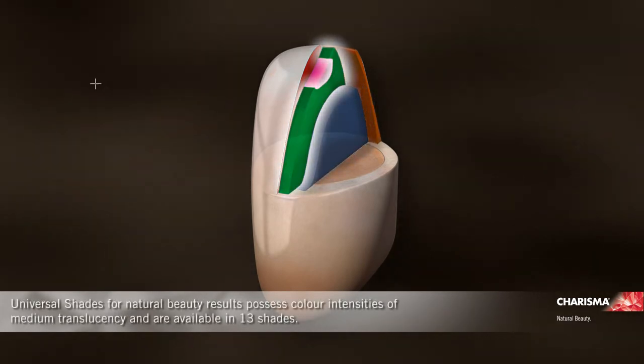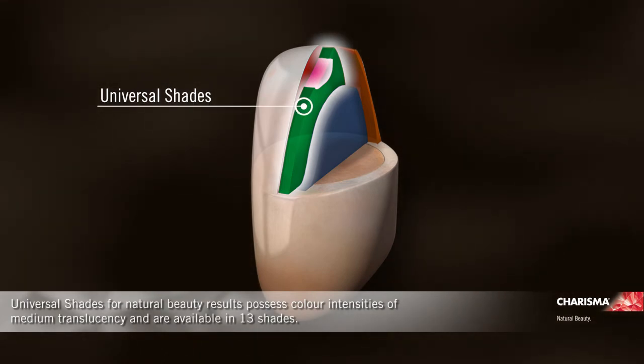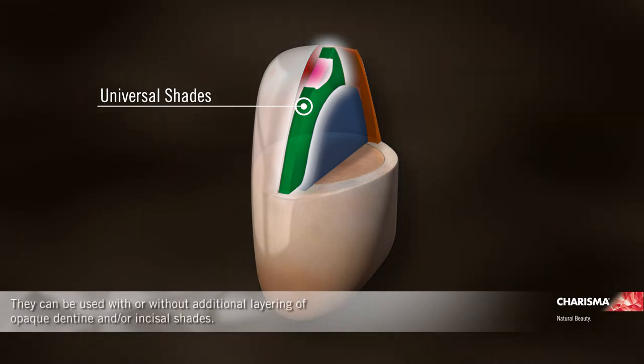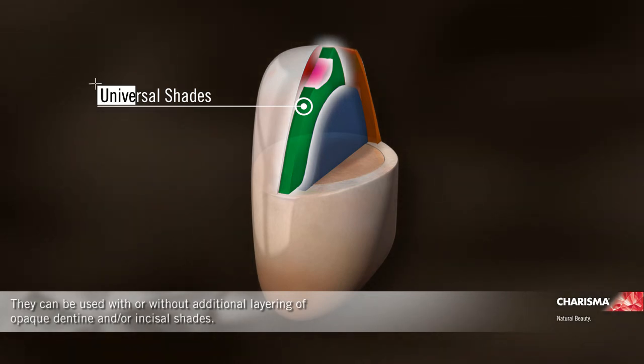Universal shades for natural beauty results possess colour intensities of medium translucency and are available in 13 shades. They can be used with or without additional layering of opaque dentine and/or incisal shades.